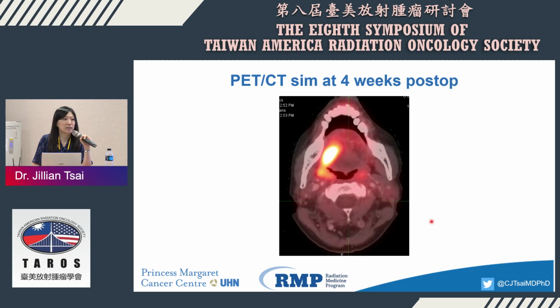Not everyone, right? So we find it very useful. And obviously, you cannot order it too early, because if after just 2-3 weeks post-op, you see the post-operative changes, and it's very confusing. So we typically order a PET CT as part of the simulation or diagnostic imaging at least 4 weeks or 1 month after the resection, especially for a large tumor, very bad disease like that.